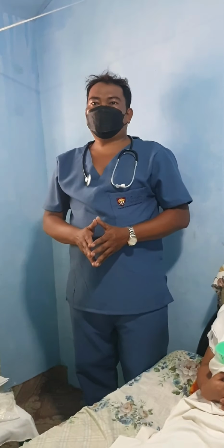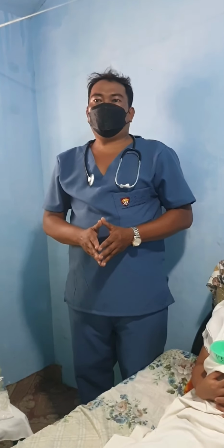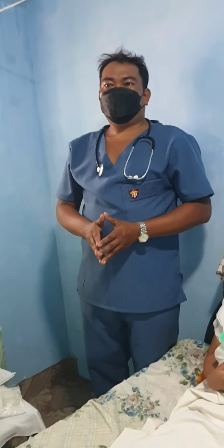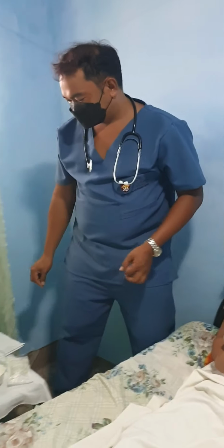Measure the distance of the tube from the tip of the nose to the earlobe to the xiphoid process, and then mark the tube at this point to determine the appropriate length of NGT to be inserted.